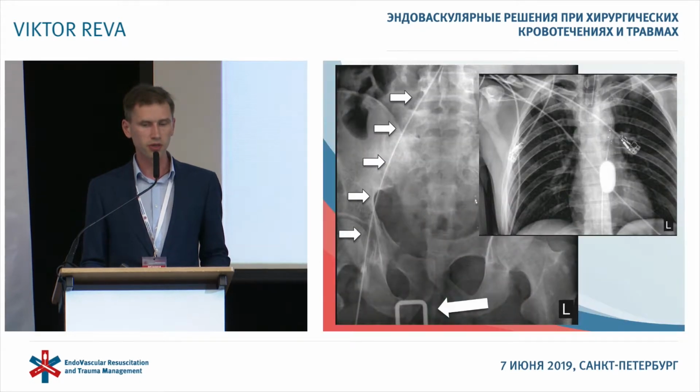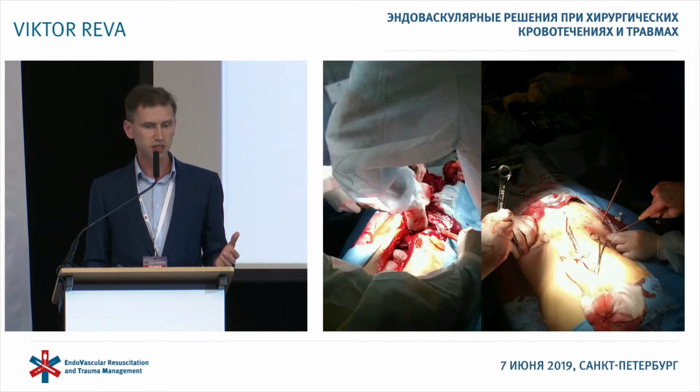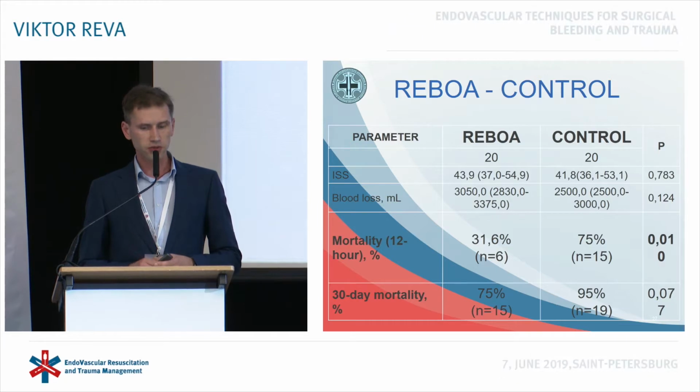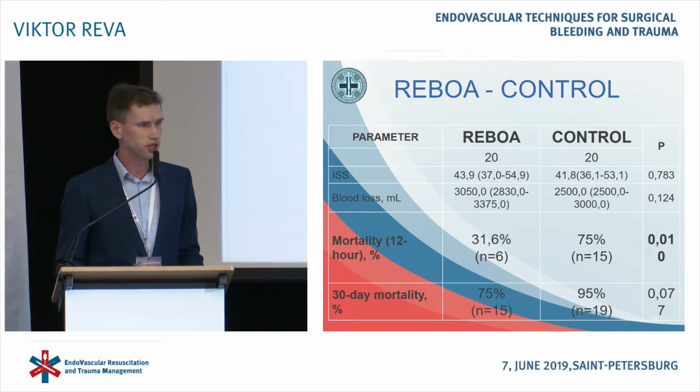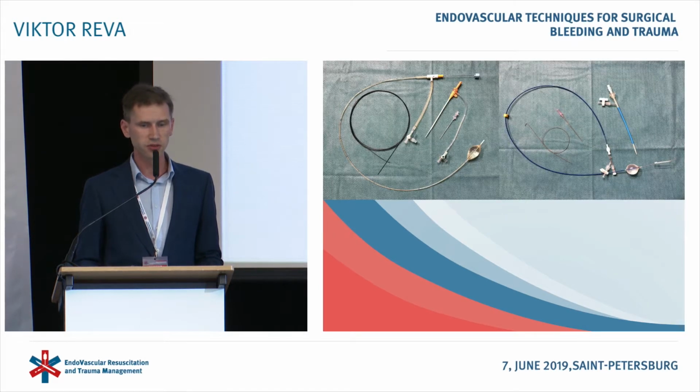Pelvic ring damage with such a large hematoma. First pictures were performed with a balloon installed already. The patient was delivered without pressure. He was stabilized. Tamponade of the pelvis, fixation of the pelvis was performed, and he was operated within the framework of damage control. No trustworthy difference in terms of 30 days mortality, but we're still accumulating the data.